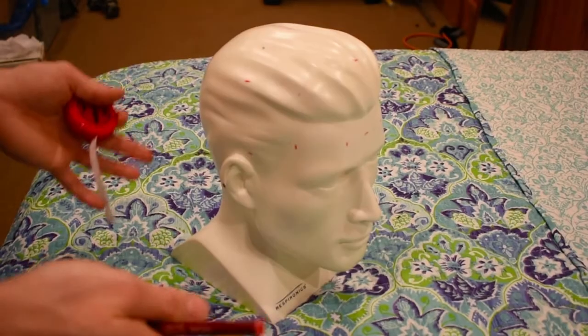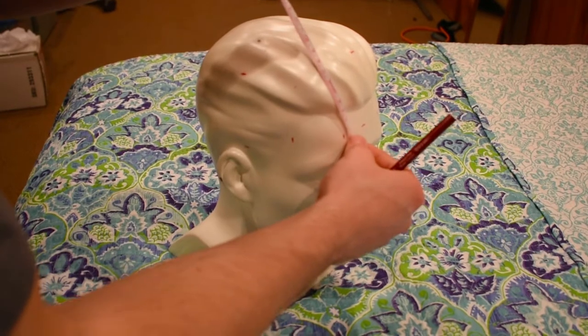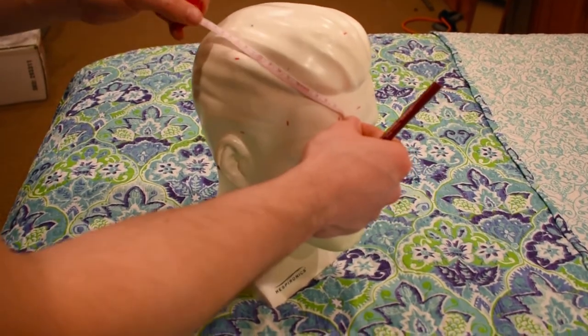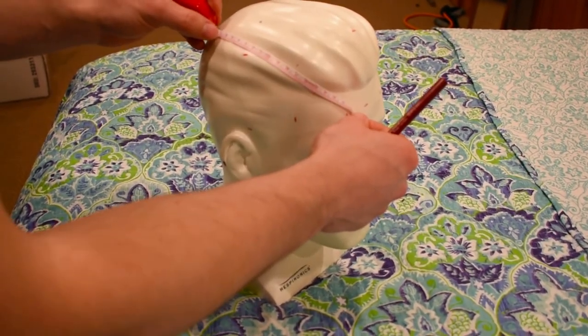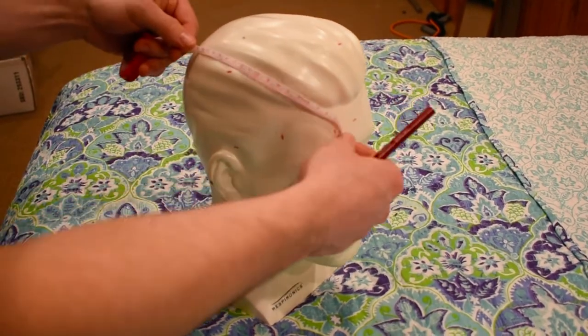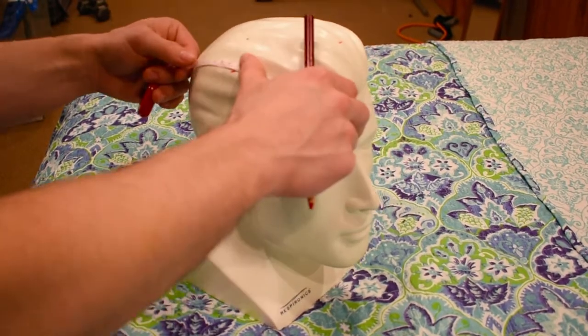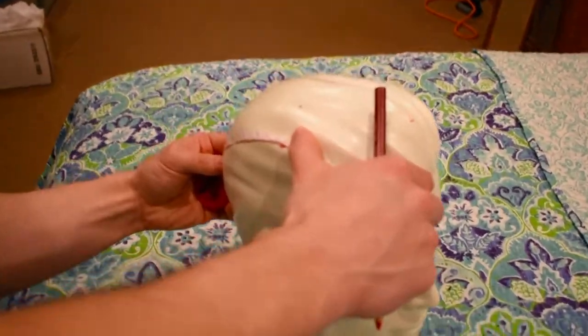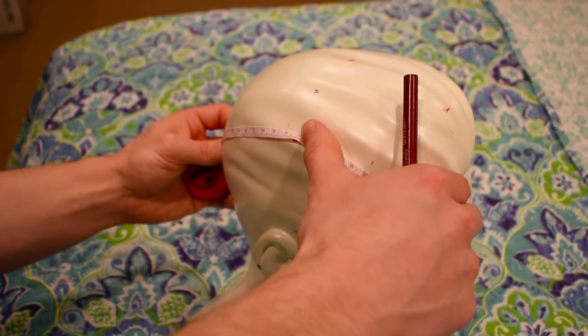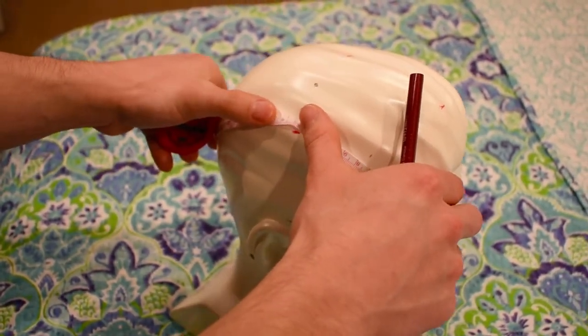So now we're going to do the same thing on the right side of the head. We're going to measure from FP2 through C4 all the way back to O2. So it should be the same measurement.